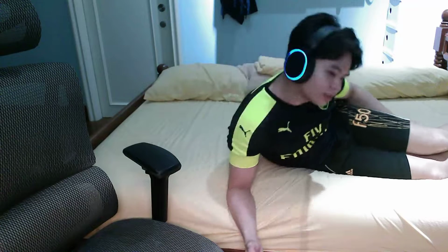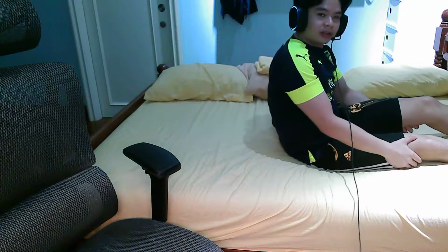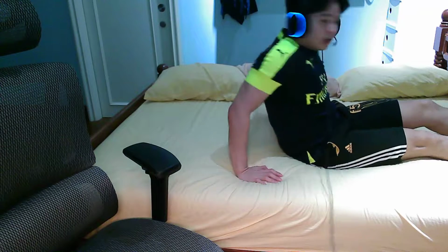Okay, so just keep practicing this motion to really build up the momentum, and then on the count of three, fling yourself up into the long sitting position. Okay, so 1, 2, 3. Okay, and then you are in the long seated position. Okay, like this. So I have to move back a bit because my bed's kind of short for me.